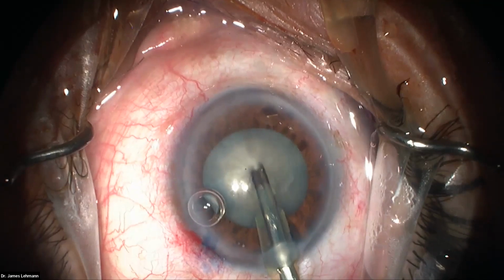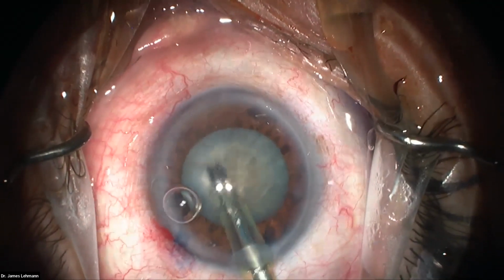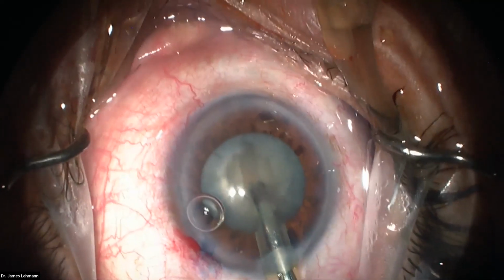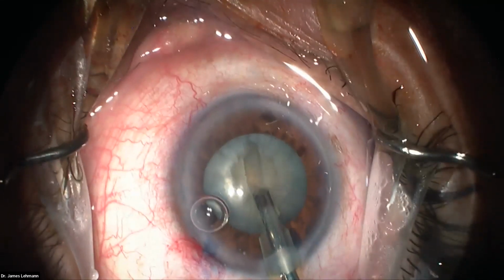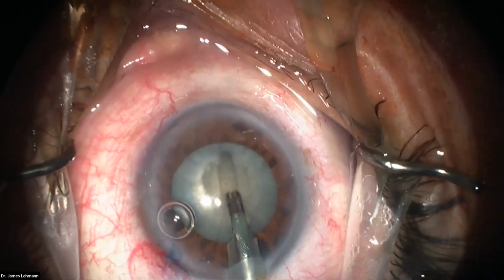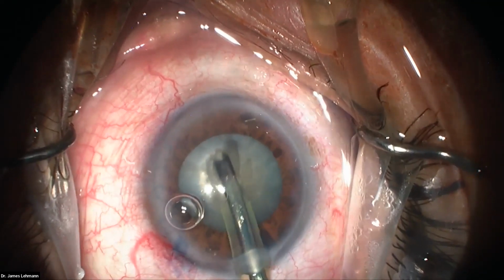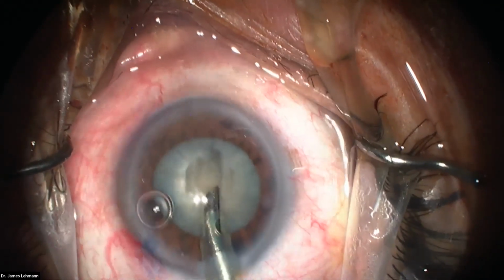Divide and conquer here. I'm just going to make a central groove. You see, I'm clearing a little bit of space in the same size as the Rexis. And then I'm kind of clearing some. So it's cutting okay. It's not the most dense cataract in the world, but it's still fairly dense. Now, what size groove am I doing here? This is about 1 phaco tip. You can go like 1.5 if you want. So I can make that a little bigger here. That improves your visualization.